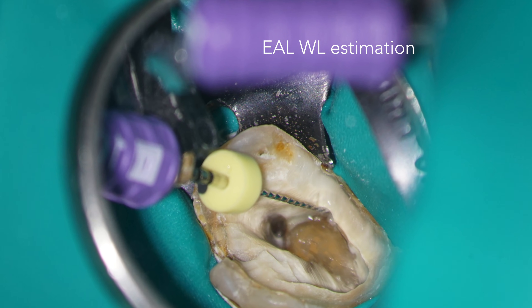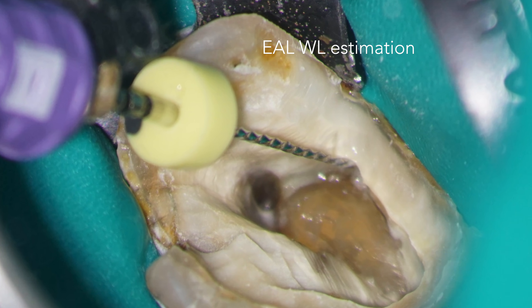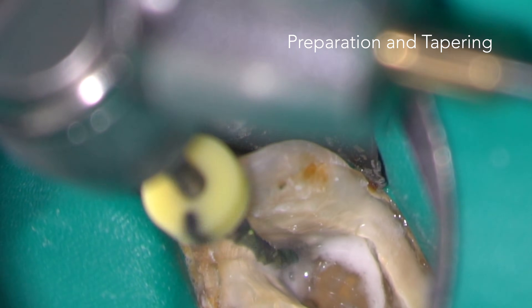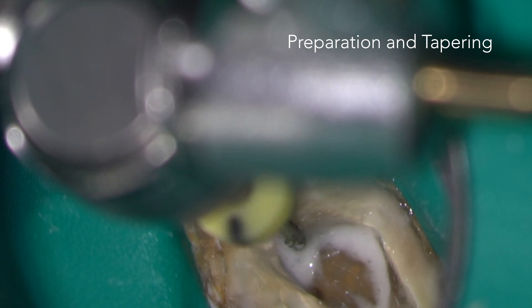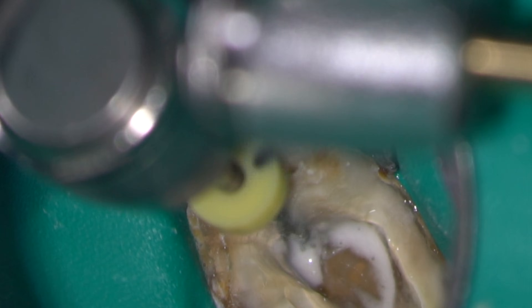The electronic apex locator is used to confirm the working lengths of all the canals to a reproducible reference point. The size 10 stainless steel hand file used to confirm the working length has created a glide path, which can now be tapered using rotary or reciprocating instruments.